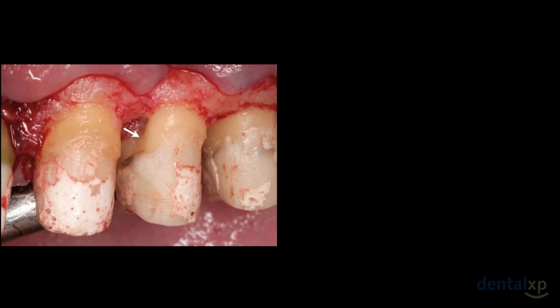Just apical to the arrow is a defect in the bone related to the concavity. When I'm doing definitive periodontal restorative treatment, I don't like to consider doing bone regenerative procedures which can have questionable prognoses. So in this case, we're going to remove the defect through osseous contouring.